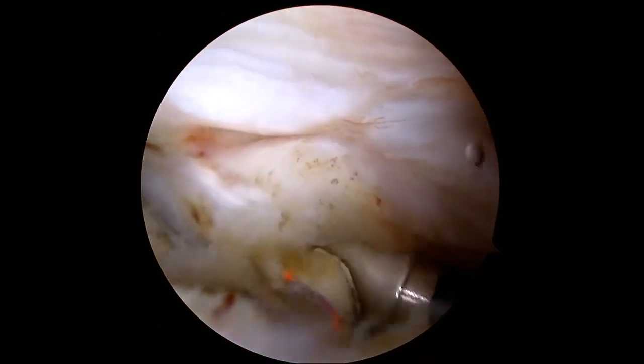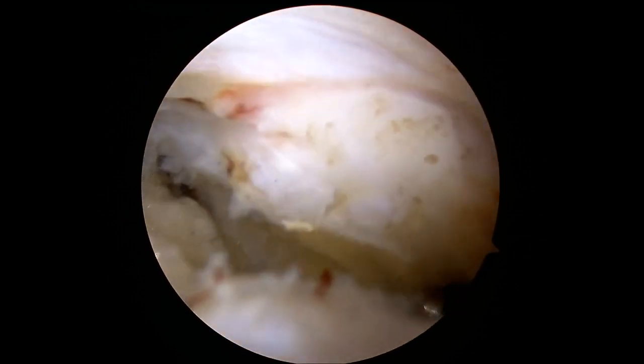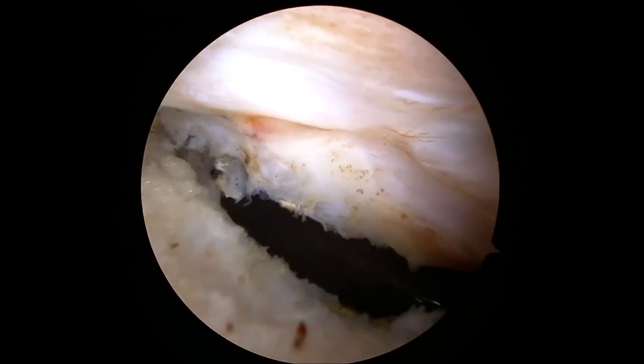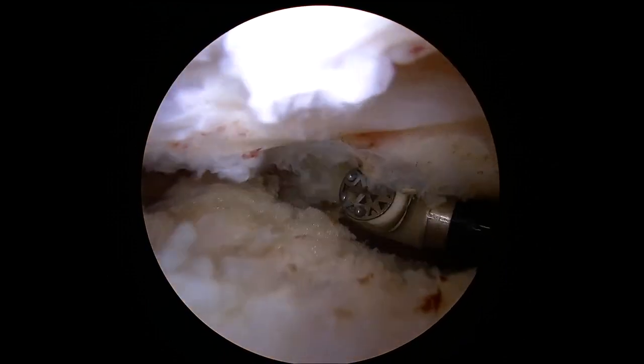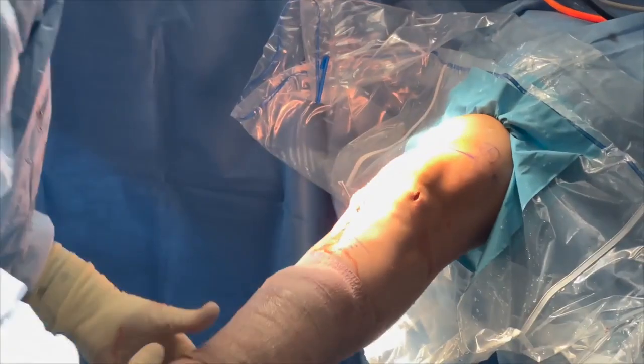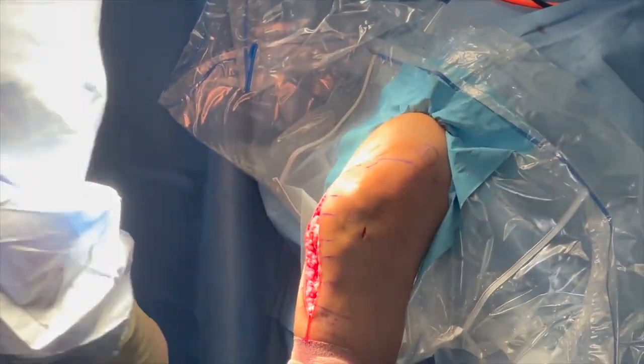The cartilage of the knee may also be assessed via arthroscopy. This patient has chondromalacia, as evidenced by fragmentation of the articular surface. Therefore, patellar and trochlear groove chondroplasties are performed. At this point, the patient has 120 degrees of flexion of the left knee.